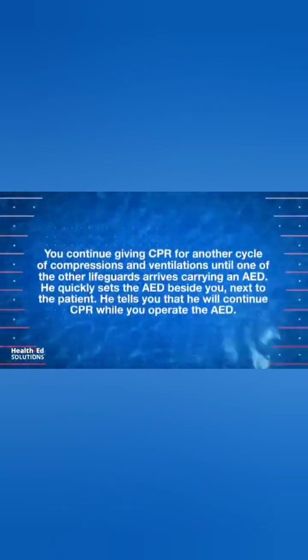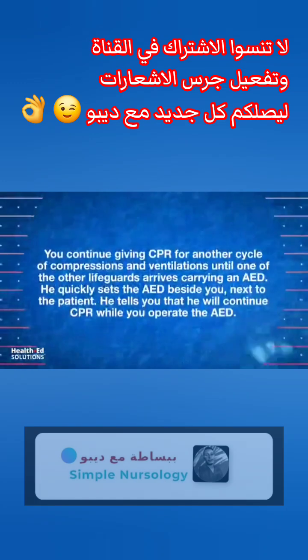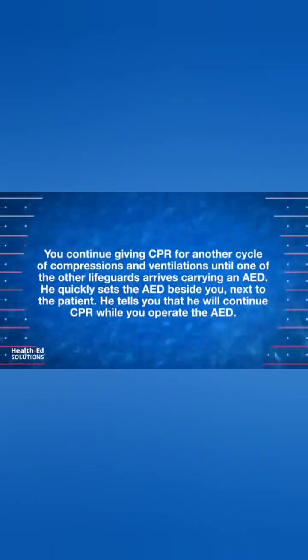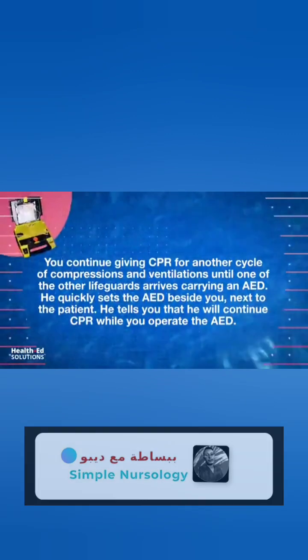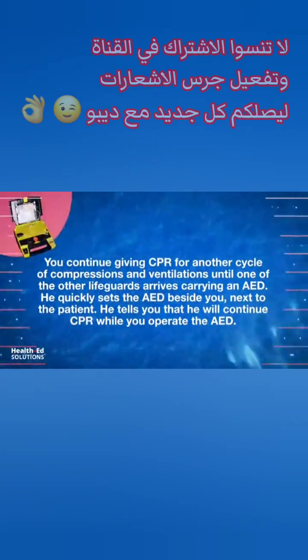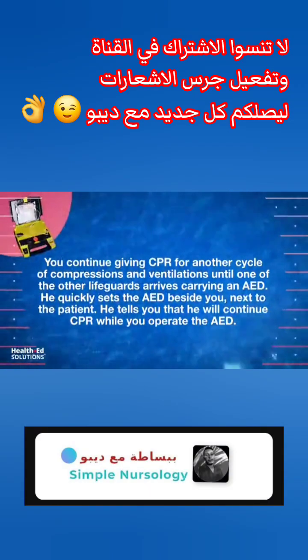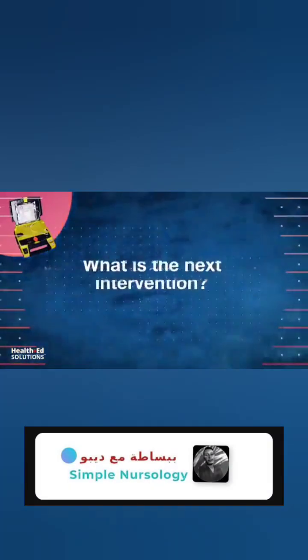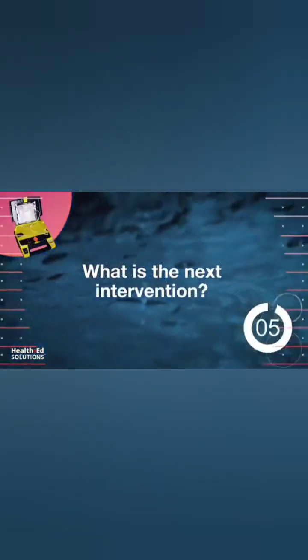You continue giving CPR for another cycle of compressions and ventilations until one of the other lifeguards arrives carrying an AED. He quickly sets the AED beside you, next to the patient. He tells you that he will continue CPR while you operate the AED. What is the next intervention?